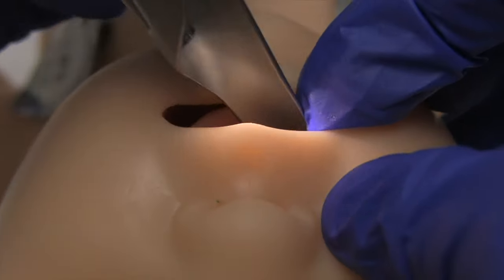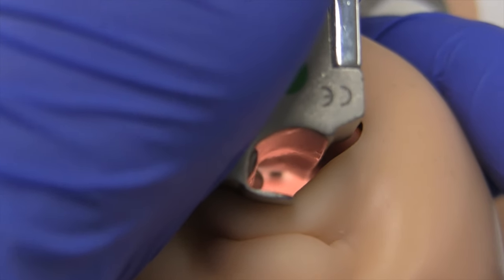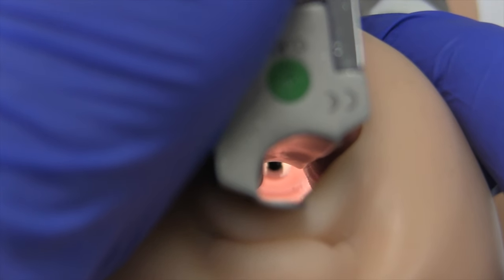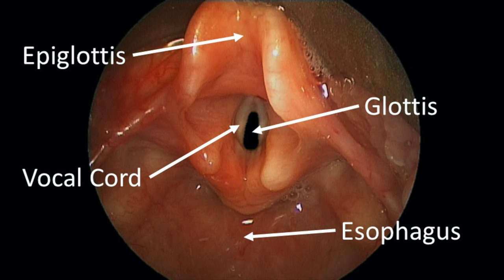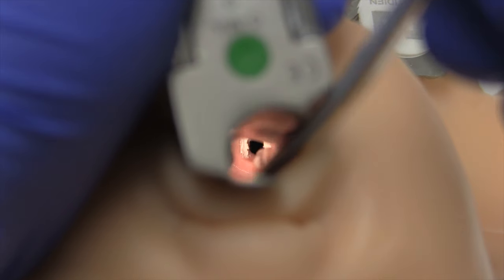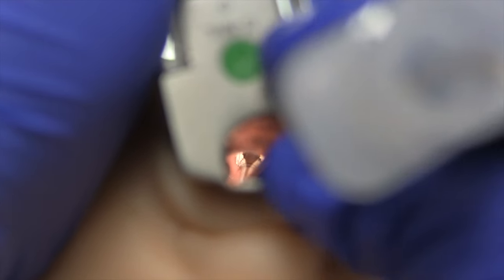To intubate, place the laryngoscope blade in the baby's mouth. Place under the tongue and lift up. Lift up in the direction of the handle and be careful not to rock back. With the blade, gently lift up the epiglottis so you can visualize the cords. Knowing your upper airway anatomy will guide you. Insert the endotracheal tube from the right corner of the mouth so as not to obstruct your view until you are passing through the cords.